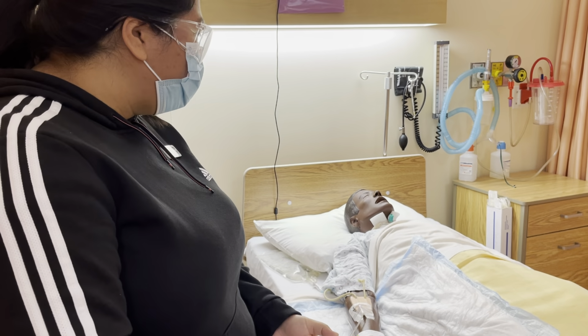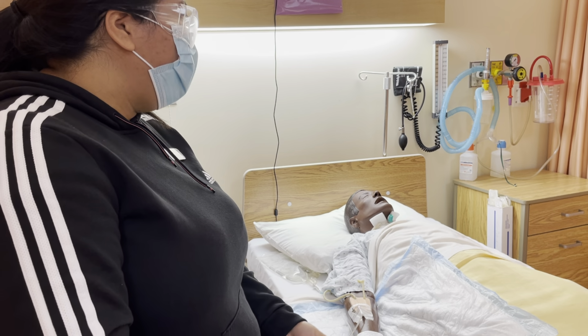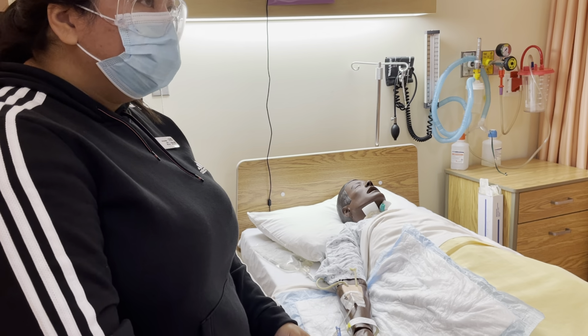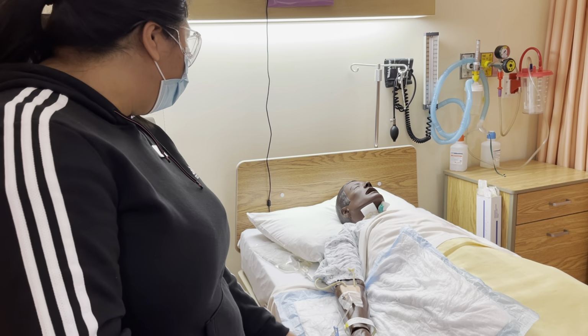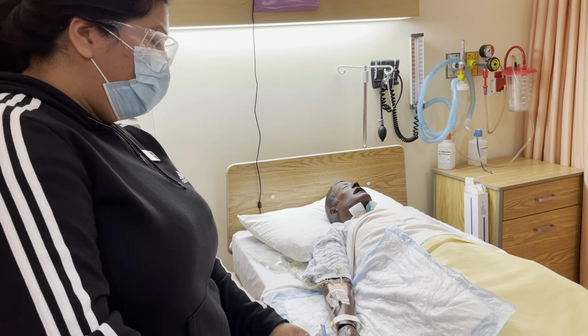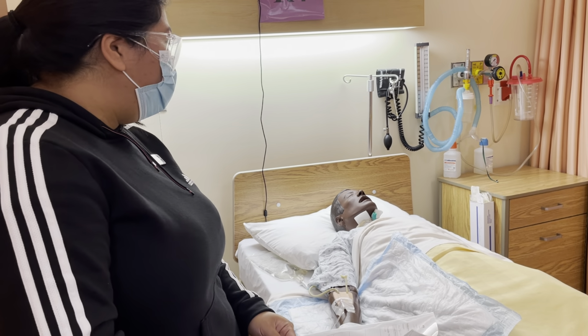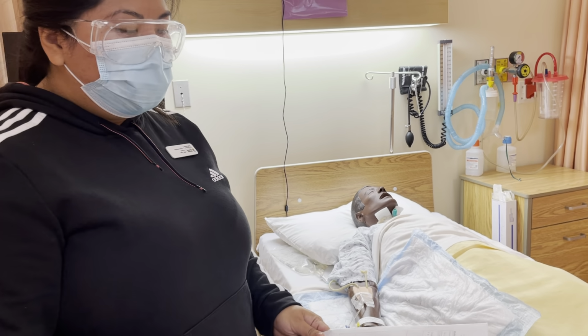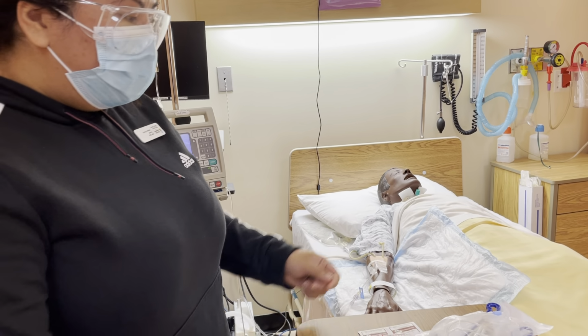I'll be back in half an hour to assess you for the side effects. But if at any time you start feeling these side effects, you have your call bell, and you can let us know right away. Are you okay with me administering this medication? Our patient agrees, so we'll go ahead and administer it.